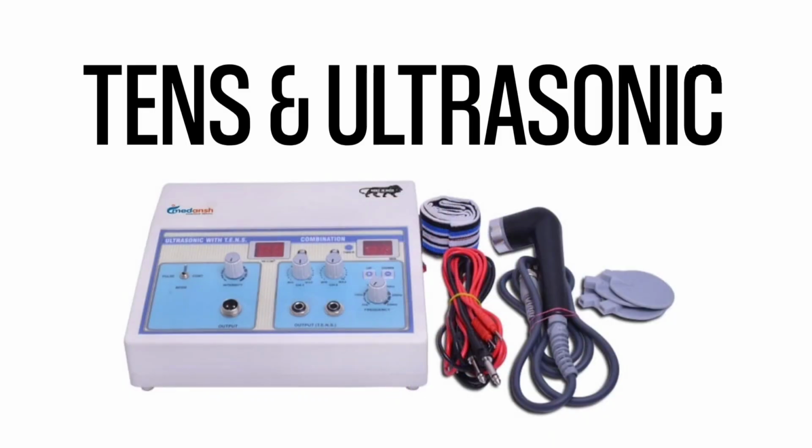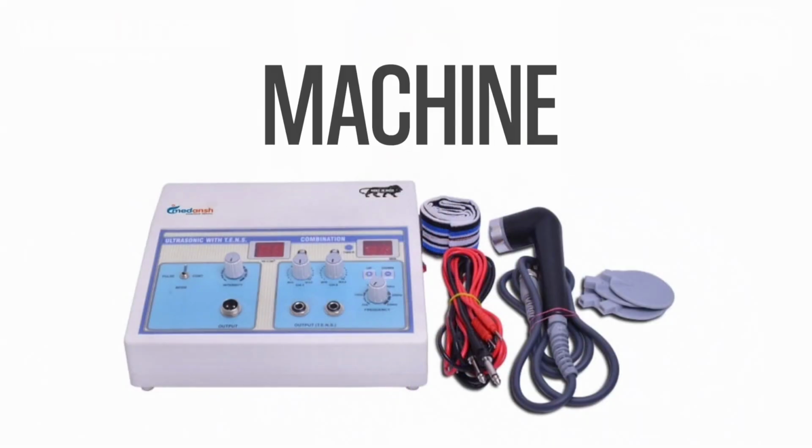Recently, I got a chance to visit Prasan Medical Solutions Private Limited, Coimbatore, where we got to know about the TENS and ultrasonic sound therapy machine. The TENS machine basically works by sending minimal electrical signals to the body. By using this, we can reduce pain and inflammation in our muscles. So it is very useful for sports persons and elderly people.